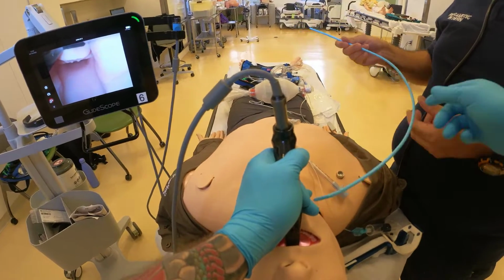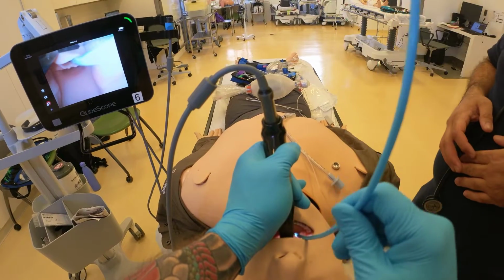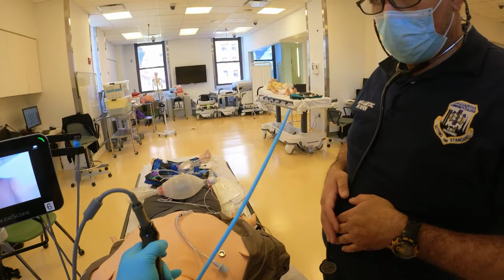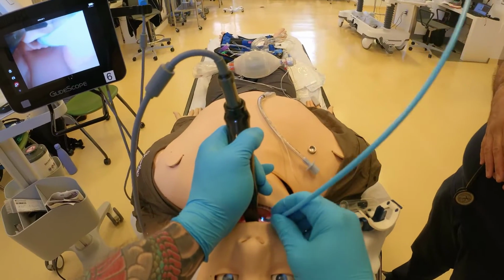So now look at this, right? So if I'm in the trachea, I'm going to hit hold up. Hold up is usually right main stem bronchi. It means this doesn't go any further. So if I am here, you see how much tip is sticking out from the mouth, right? I can't go any further. I have hold up at the right main stem.